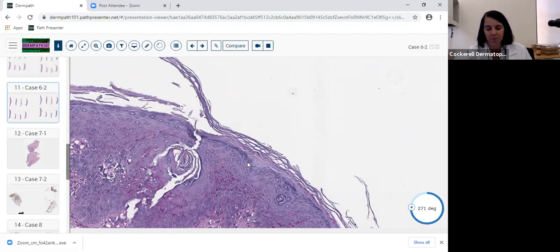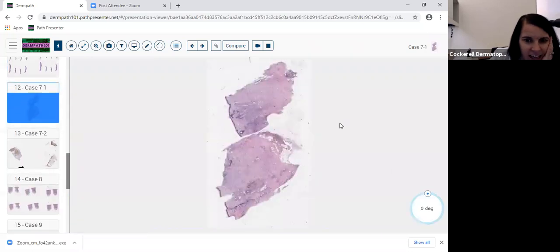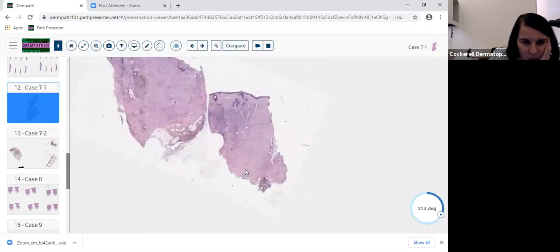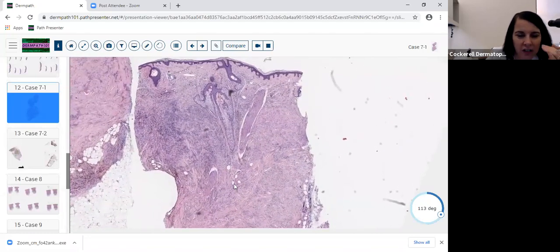So sandwich sign isn't perfect, but it's a great way to start to suspect tinea and then to order a PAS. So we went over that. We pretty much beat that. But they will show you that on the board. I had one of those. They like you to miss it because you're not looking in the stratum corneum. You're so focused on the dermis and trying to figure out what the heck's going on in the dermis and the epidermis that you don't even look at the stratum corneum. So don't forget to go through your systematic way of looking at a slide from top to bottom or bottom to top. I don't care, but just do it one way or the other.